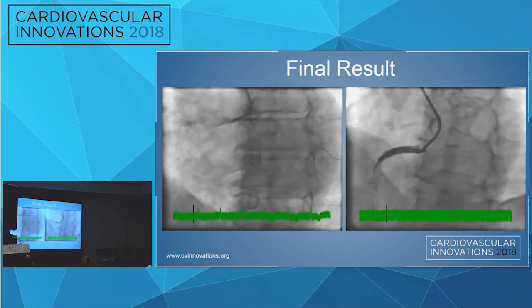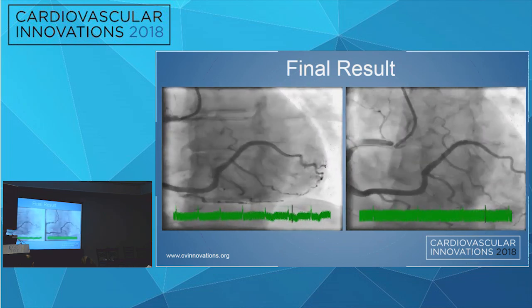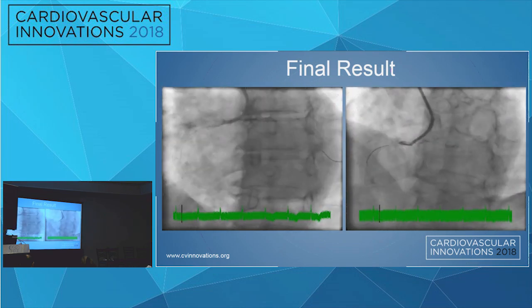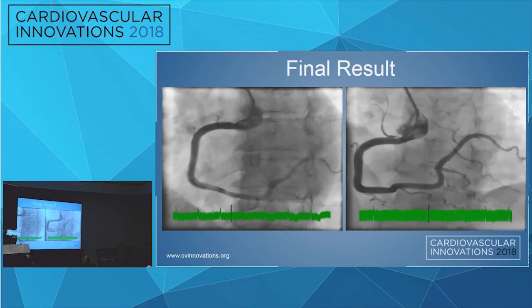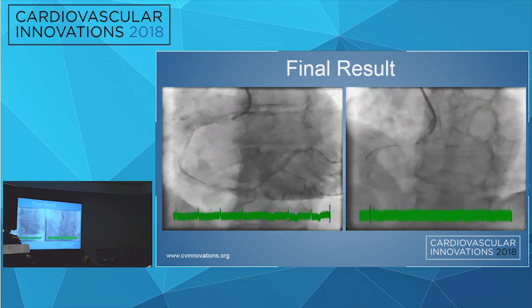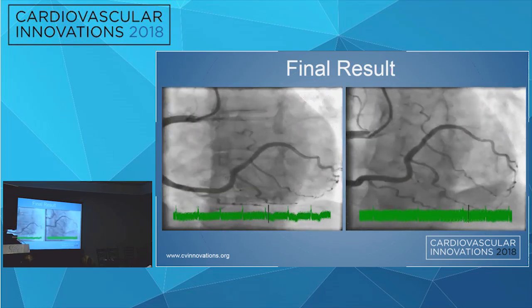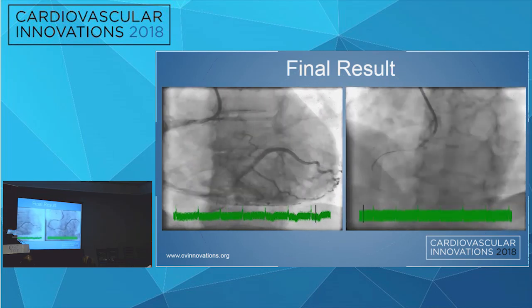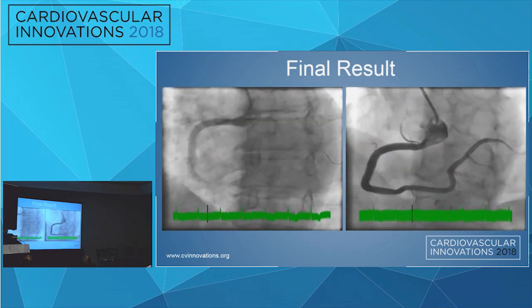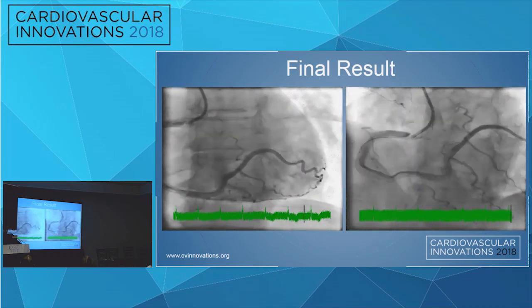Big right coronary. As I mentioned a couple moments ago, I actually used 6.0 peripheral balloons for post-dilating these stents because, of course, the coronary balloons don't come that large. For anyone who's wondering, or maybe you all are already aware, the 5.0 Resolute Onyx stent maximum expansion is 5.75, but I really took it up to high pressure with a 6.0 balloon. I went to 14 atmospheres, 16 atmospheres, and really wanted to make these stents as large as possible.